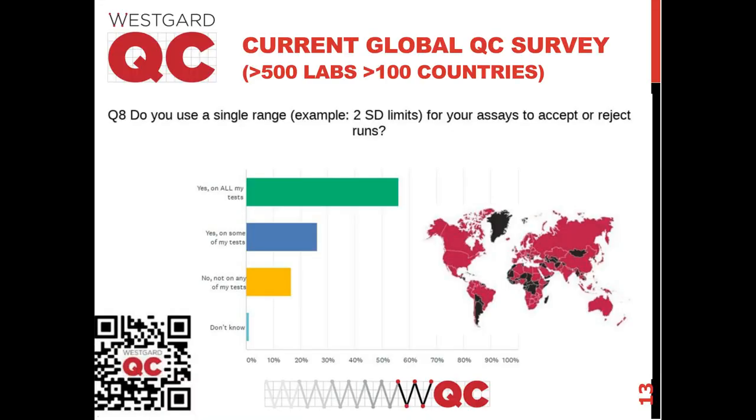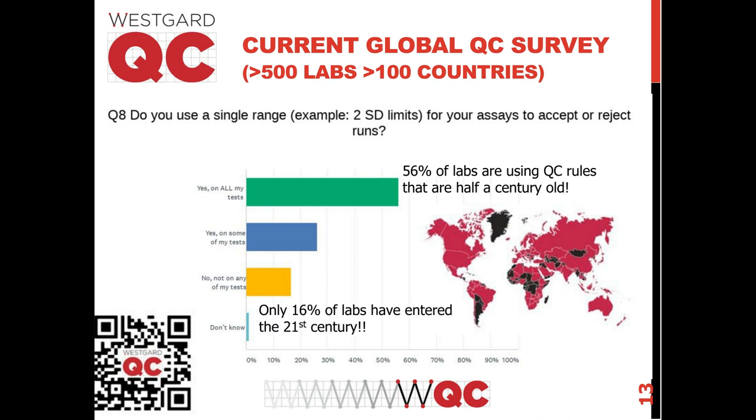And now we can compare ourselves to the global climate, where 56% of labs worldwide are using the 2SD control practice, and that's half a century old. So the reason we stick with 2SD limits, it's more of a tradition than a science. And a very small percentage are not using 2SD limits at all.